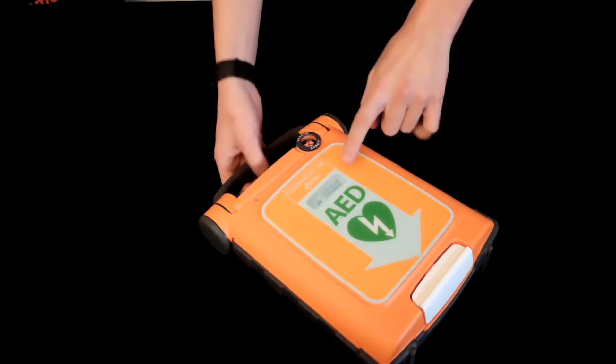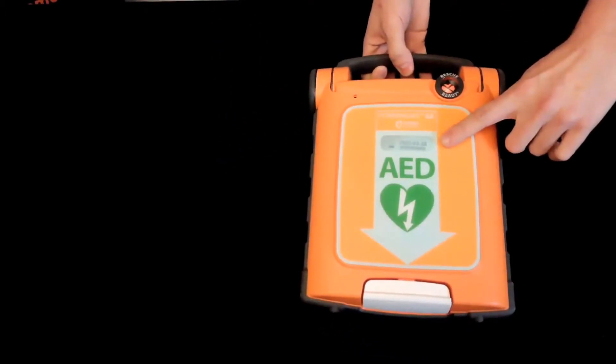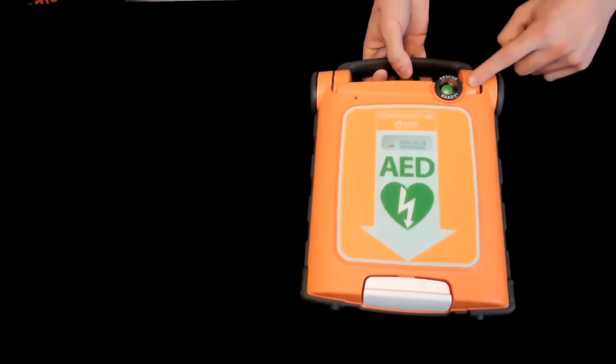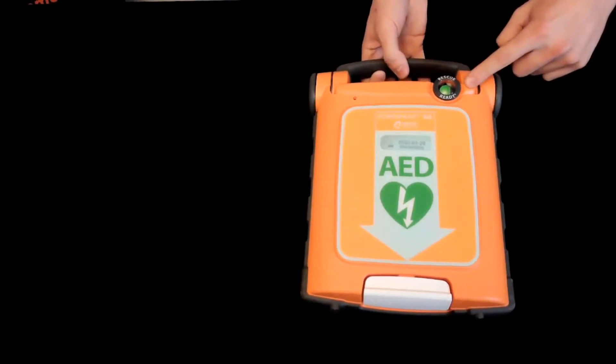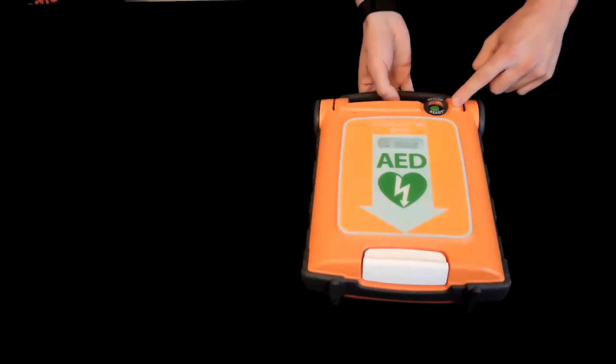Verify that the pad expiration dates are easily visible through the front window on the lid of the unit and that the rescue ready indicator returns to green after 10 to 15 seconds.